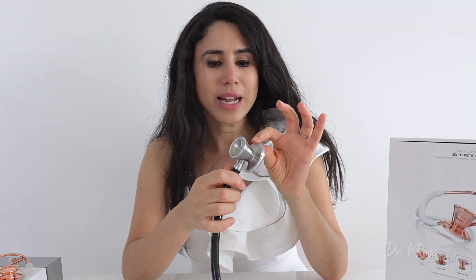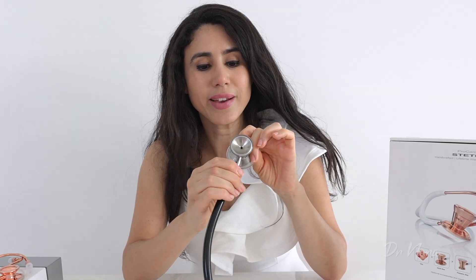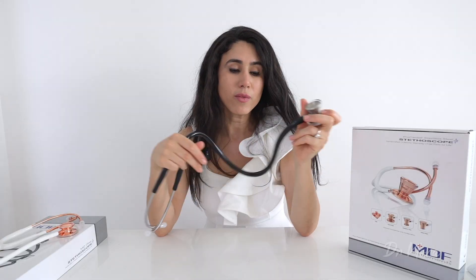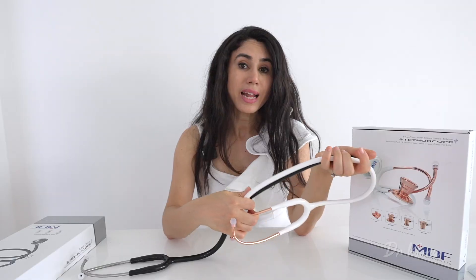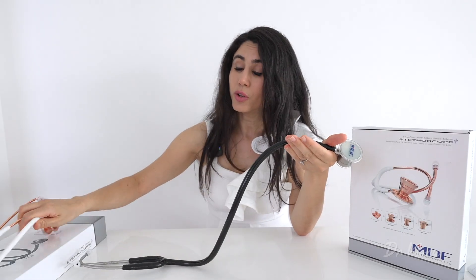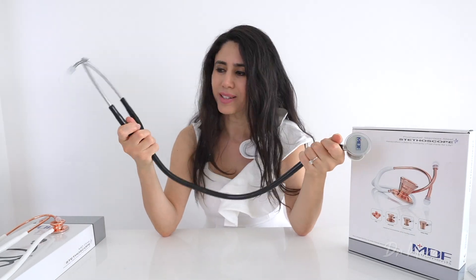Like with any stethoscope, you activate the bell or diaphragm just by turning the chest piece, and there's a little green dot that tells you which side is activated — really important when examining patients. Moving on, the tubing is a lot thicker than the MD1 stethoscope, and as their literature states, it's to prevent losing sounds as you listen through the earpieces.